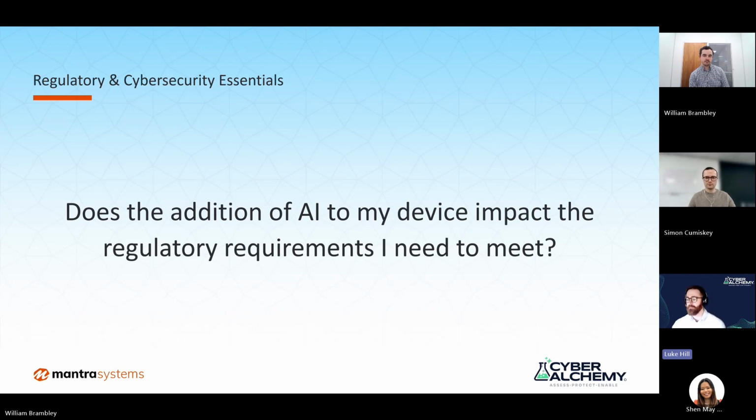and then also, as you mentioned in the question there as well, ensuring that you've got that repeatable and it's not going to be updated without you knowing, right? Because that's obviously going to cause some problems with your ongoing testing that you're then going to have to validate that that has happened, and if you're not sure what's changed, then that's obviously a bit of a problem.